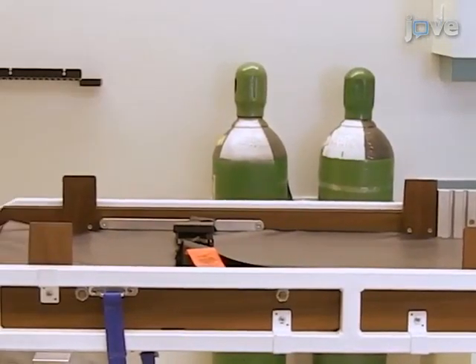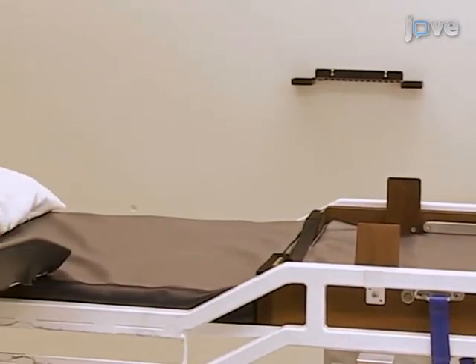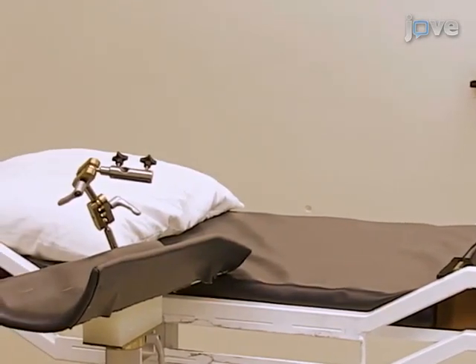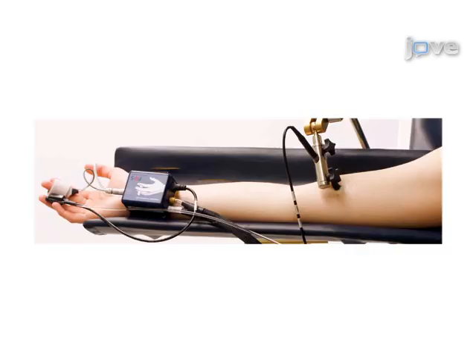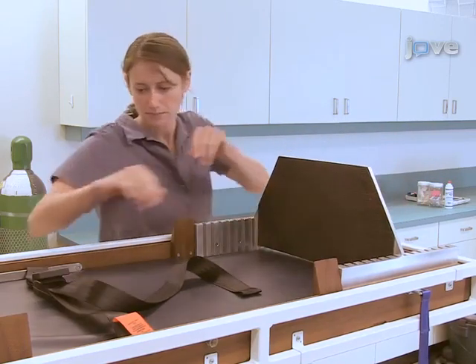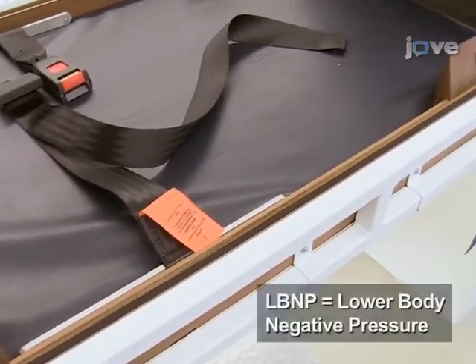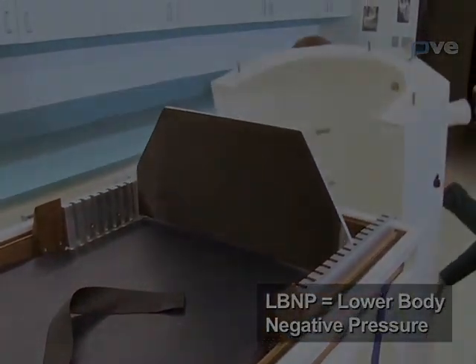The manually adjustable tilt table is capable of moving from minus 15 to plus 60 degrees in 10-degree increments. It includes an adjustable right arm rest with an adjustable holder for a brachial ultrasound probe, an adjustable footplate for the subject to stand on, and a seat belt to secure the subject's legs. A lower body negative pressure or LBNP chamber with an attached pressure gauge.